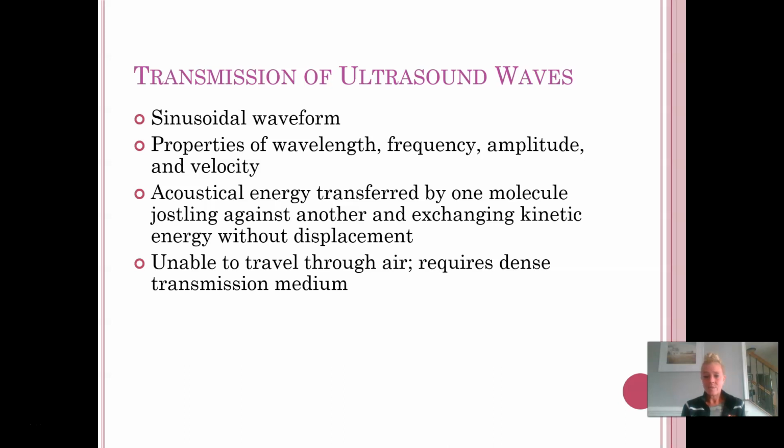Ultrasound is not able to travel through air at all. So that's why we use a transmission medium. We typically use ultrasound gel, and that's how we're going to apply the treatments in the clinic and in lab when we practice. It's also very important that when you're applying an ultrasound that you place the gel on the person or on the ultrasound transducer, and then you keep firm contact between the transducer and the patient's skin. You don't want to expose the ultrasound head to air for any extended period of time. It can actually damage the crystal inside.